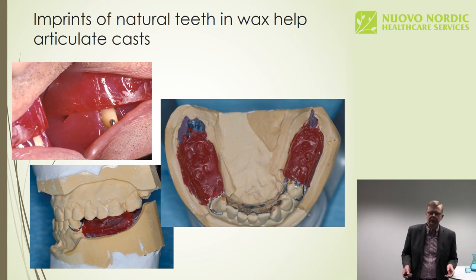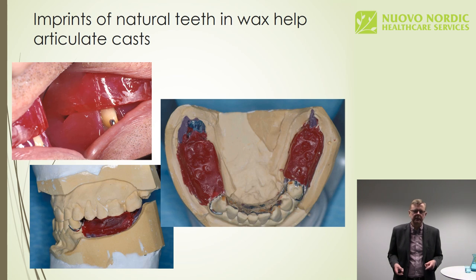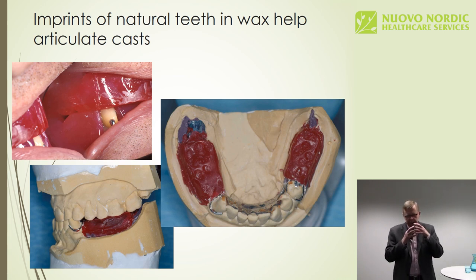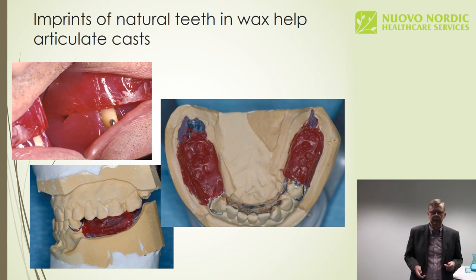If there are natural teeth in the mouth, of course the indentations or imprints of the teeth in the opposing wax rim will make it easier to articulate the wax rims and the models afterwards in the lab, and especially if there are lots of teeth, the easier it will be.